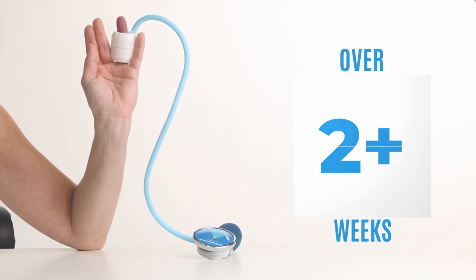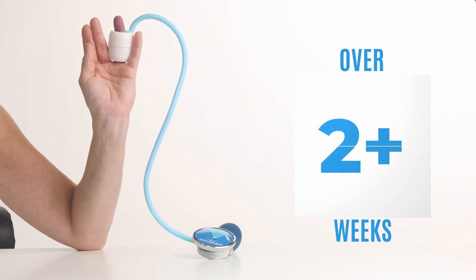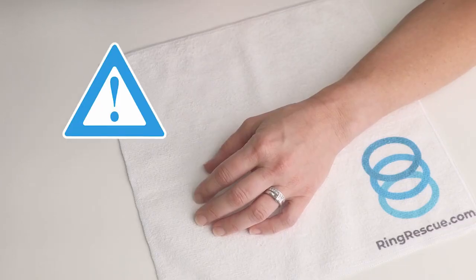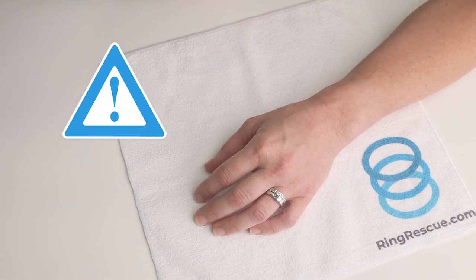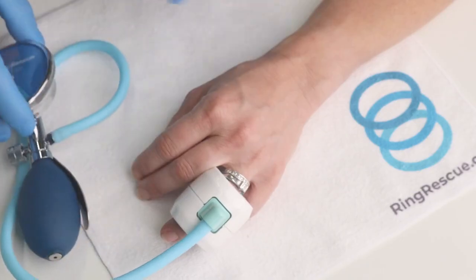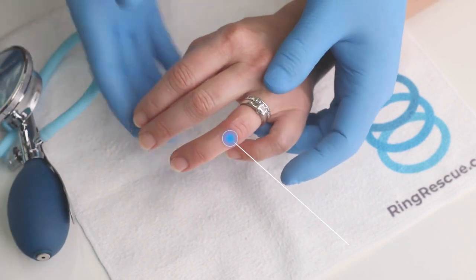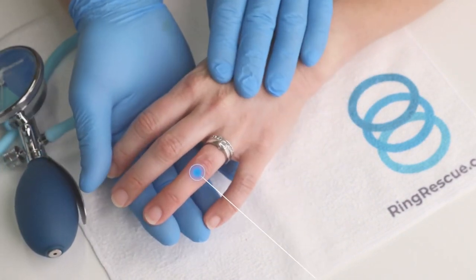When a ring has been stuck for longer than two weeks or other unique situations, we recommend applying the device for another round as the cause is most often tissue related. In unique cases like osteoarthritis and severe weight gain, you will likely need a ring cutter to remove the ring. However, in these cases our device compresses the finger to a more manageable size in order to place a ring cutter in more efficiently.